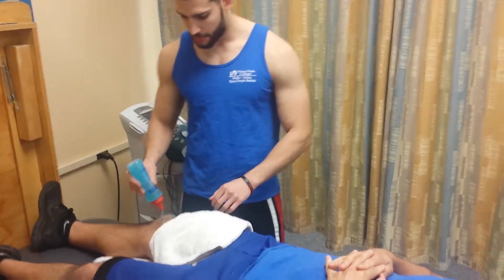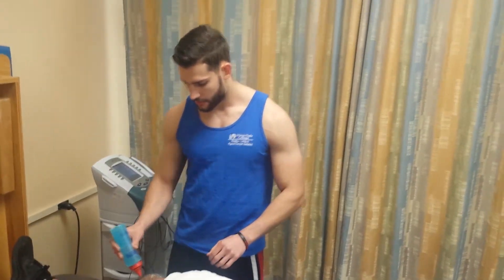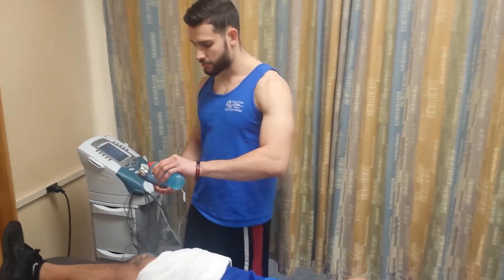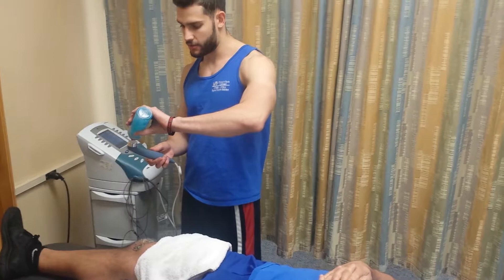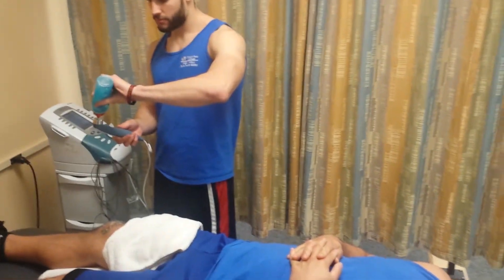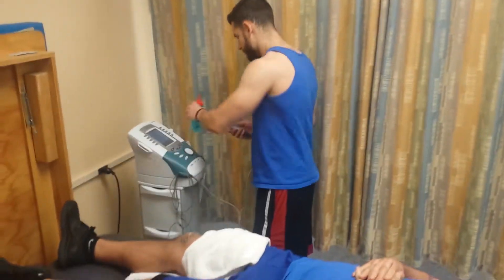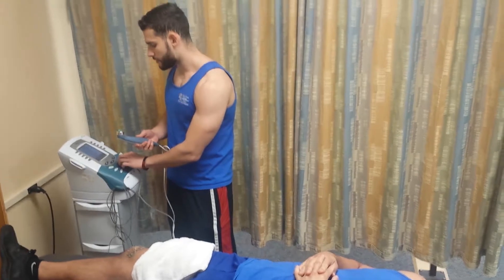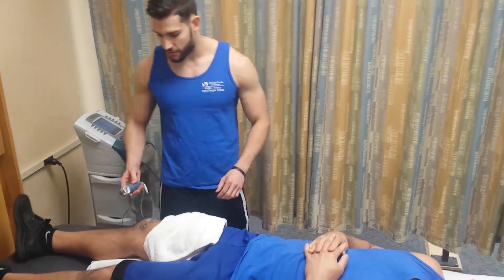We'll put some of the gel on his knee, and a little bit of gel on the ultrasound pad as well. Then we bring up the intensity to about 1.5, which should do the trick.